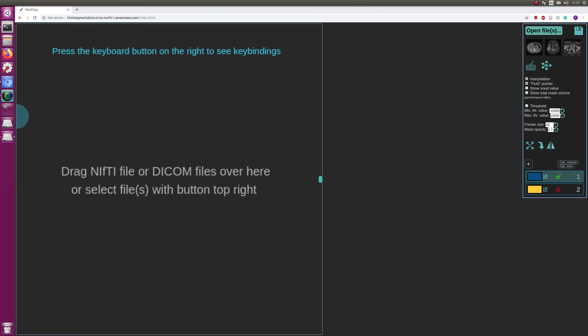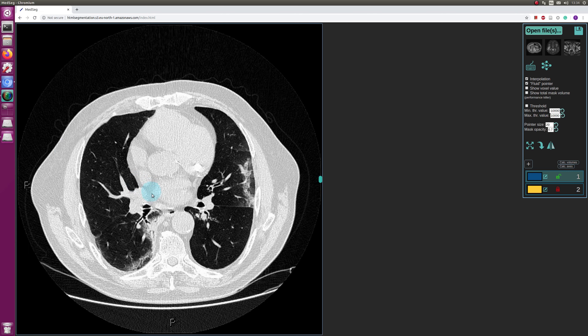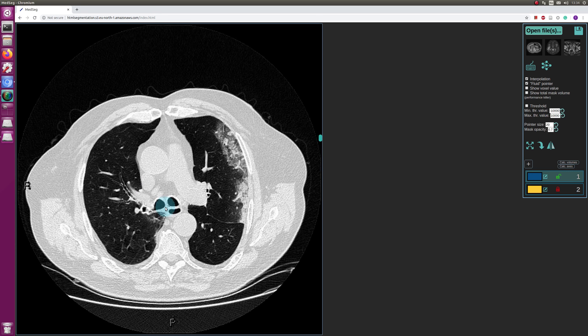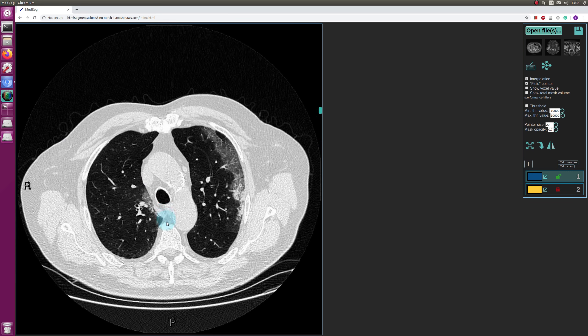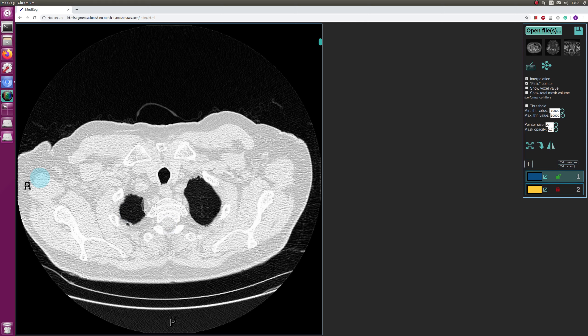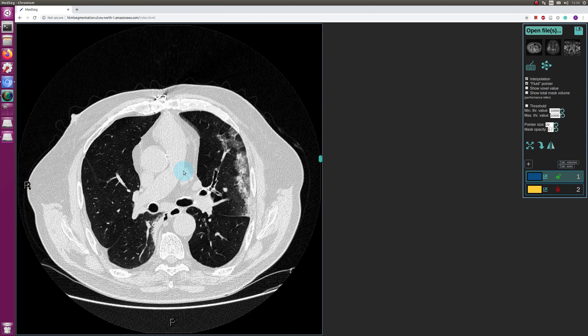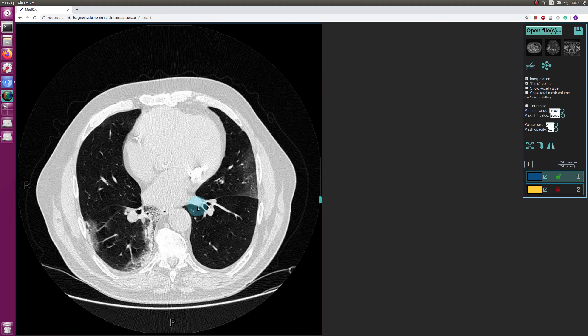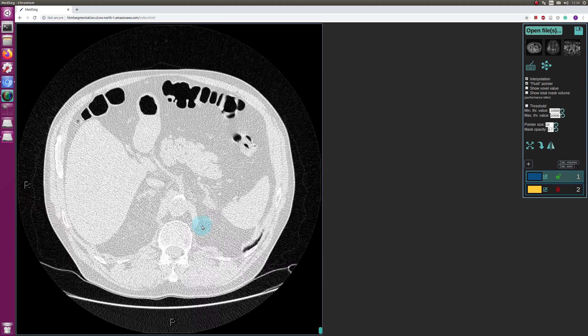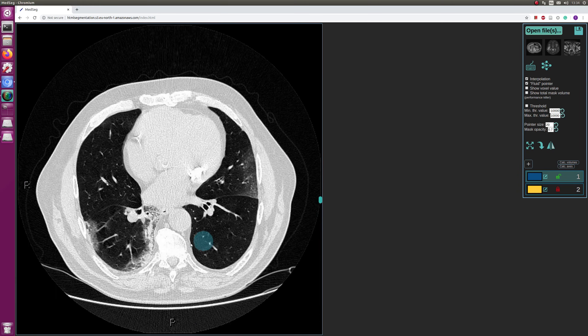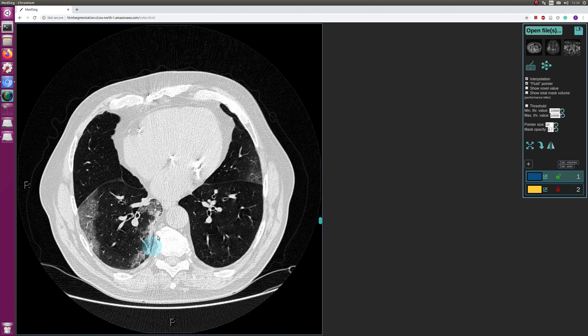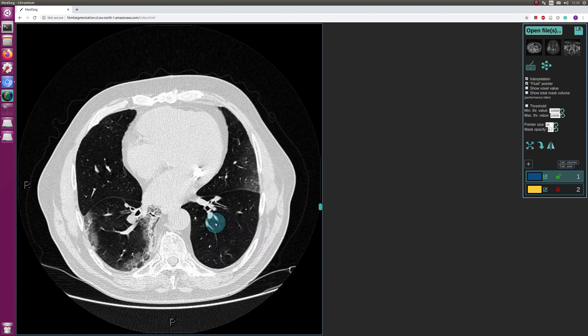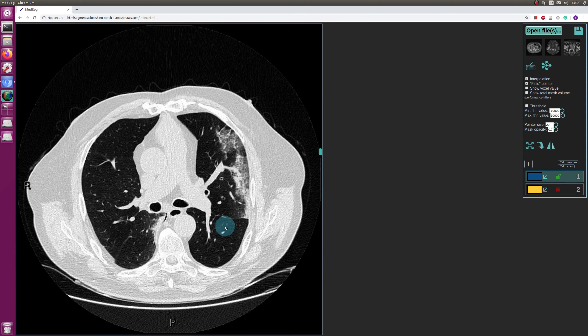This will probably be a quite long video because I will refine the segmentation and it will probably take some time. So what I did now was that I just dragged in some nifty files of a patient who has COVID-19 with the lung changes that you see, and what I want to do is just segment the lungs because we're trying to perfect the lung segmentation model that we have.